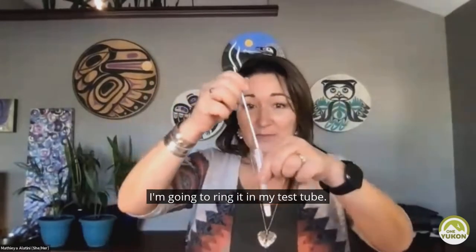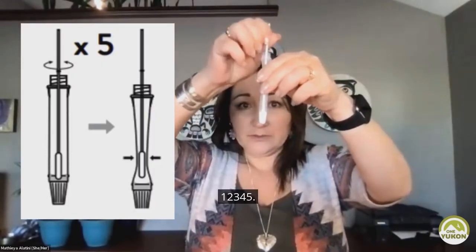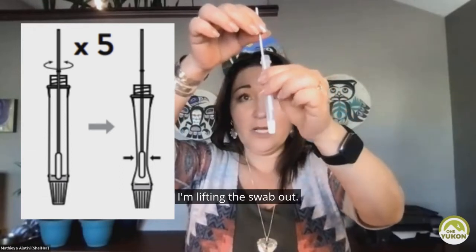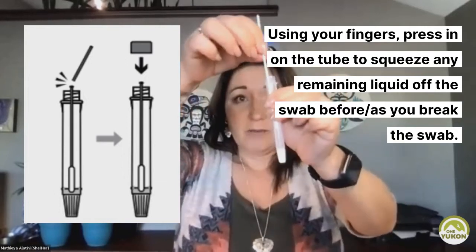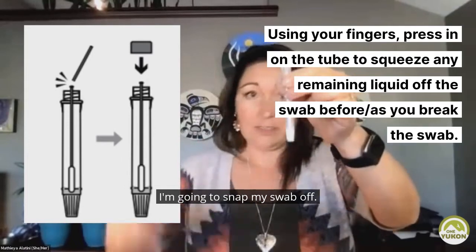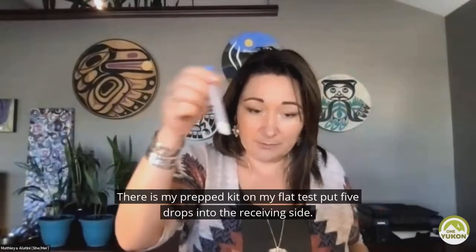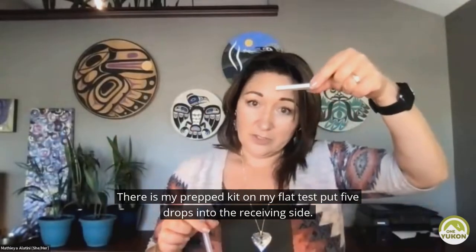I am going to wring it in my test tube — one, two, three, four, five. I'm not shaking it. I'm lifting the swab out. You'll see a break point on halfway down the swab — it's that break point. I'm going to snap my swab off. I'm putting the lid on. I'm careful not to touch the inside of the lid. There is my prepped kit.